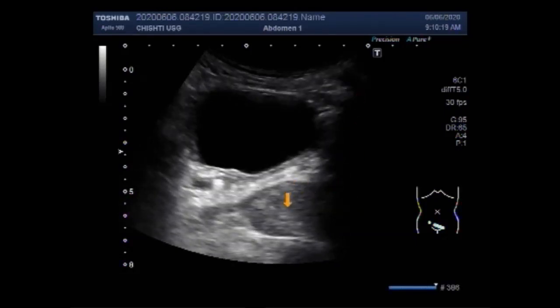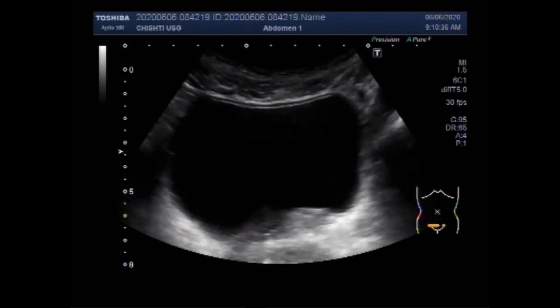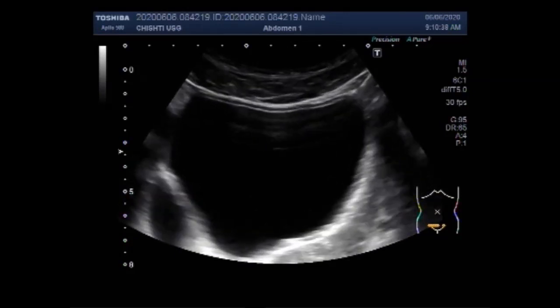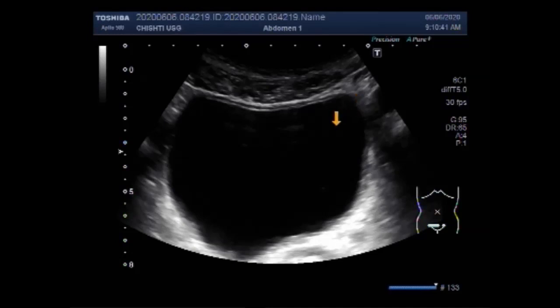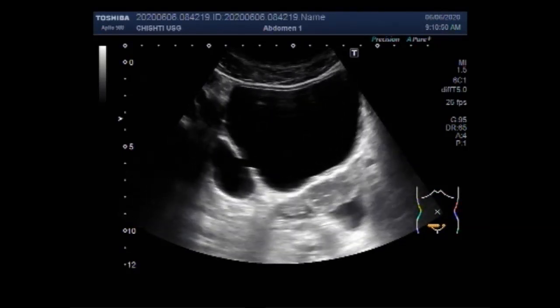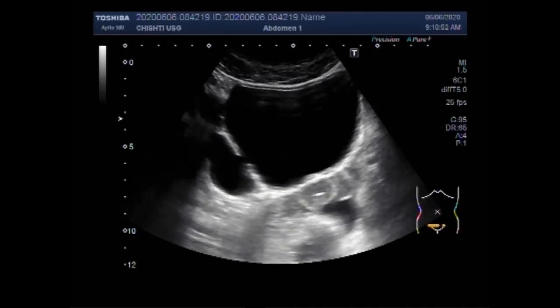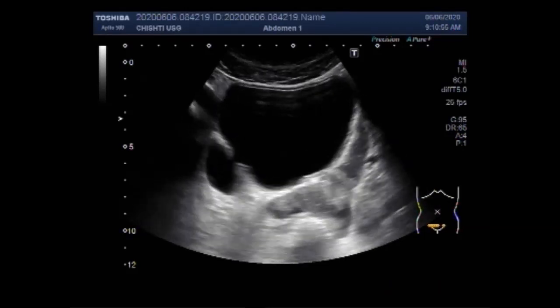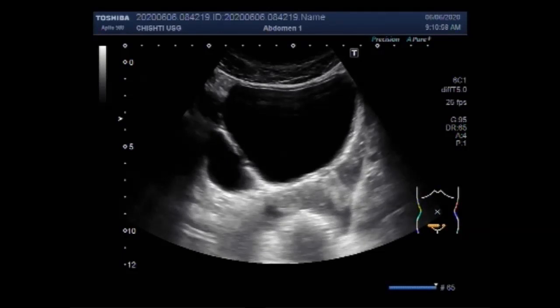Now you will see this is the prostate, and now you are going to see the diverticulum of the urinary bladder. A diverticulum is a pouch in the bladder wall that a person may either be born with — that is congenital — or get later, which is acquired. A congenital bladder diverticulum forms when some of the bladder lining pokes through a weak part in the bladder wall. With acquired diverticulum, many pouches often form.